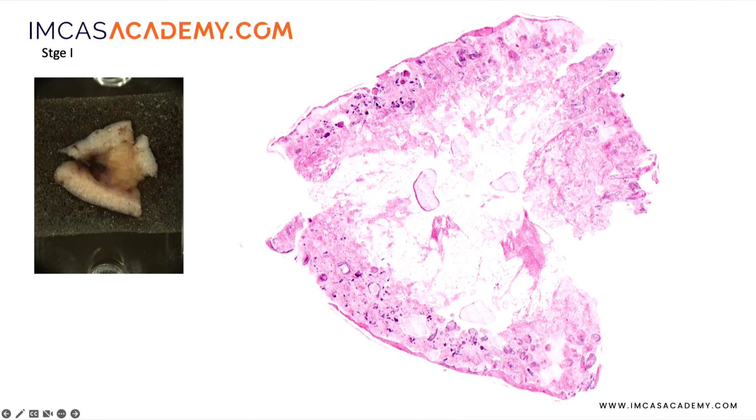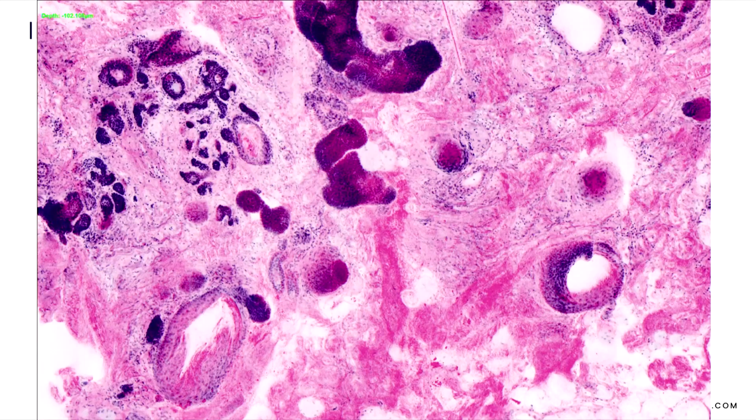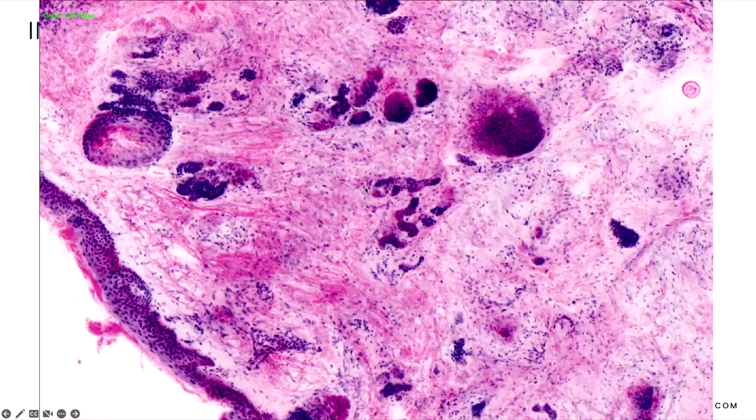It was a primary one, and here you can see in detail all the tumor presence. Okay, everything of this is positive, and this is the macro view that we are having at exactly the same time. And here in more detail, look at the tumor. It was a very, very tricky tumor. Look at this perifollicular basal cell carcinoma. Okay, look, you see the difference? This is normal. You can see here the cytoplasm, and this is tumor. Okay, nuclei are crowded. Okay, another example of the same area, of another area. So all of this is tumor presence.